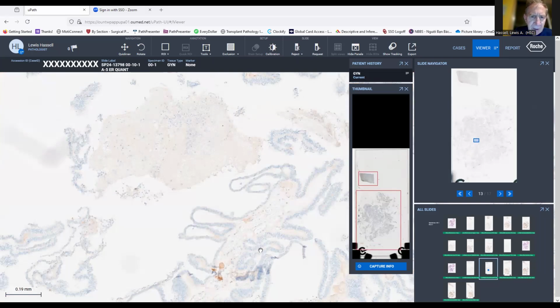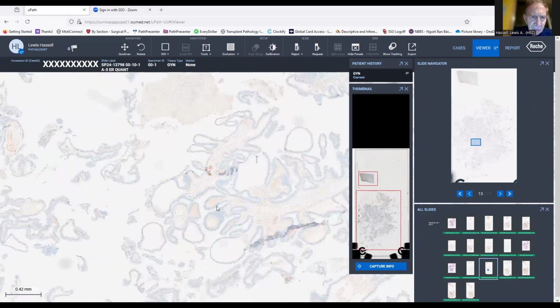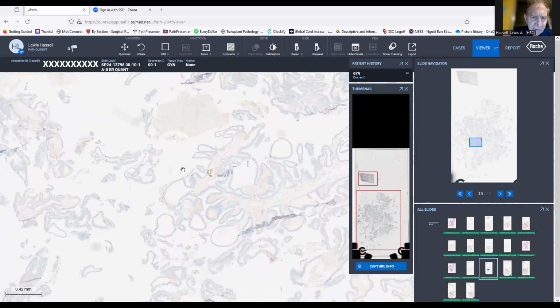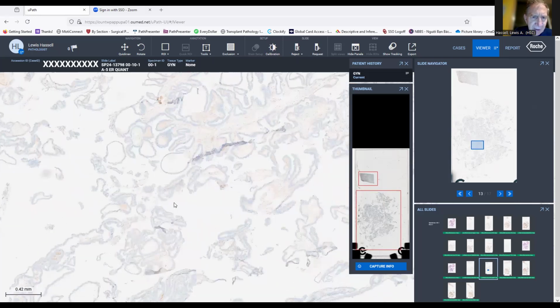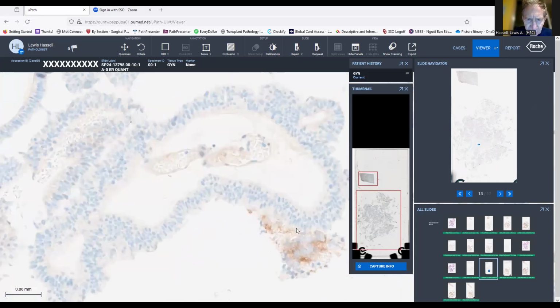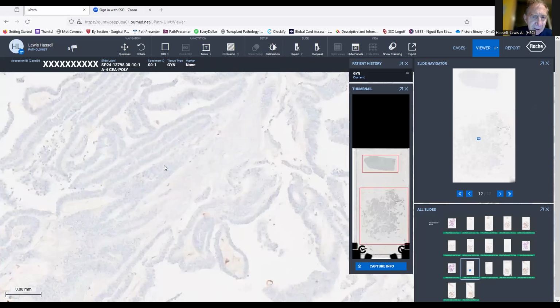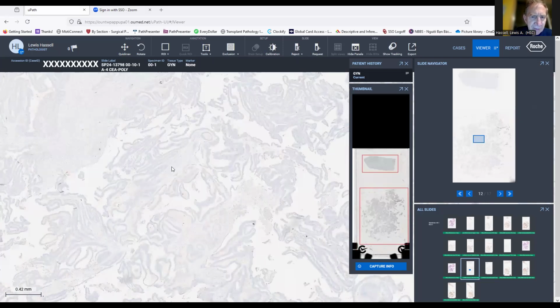Here, however, is the estrogen receptor stain. And as you can see here, this is dead negative. There is virtually no positivity, and anything that looks like staining is just artifact. That would be unusual if this is an endometrioid tumor. Looking a little further, here is the CEA staining, which we would expect to be positive if it were endocervical.